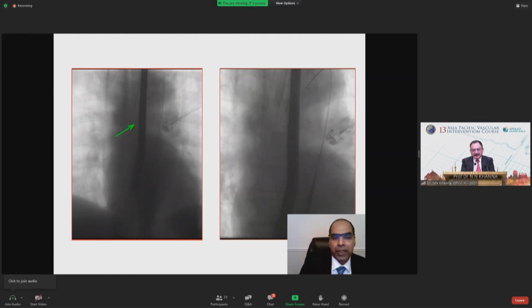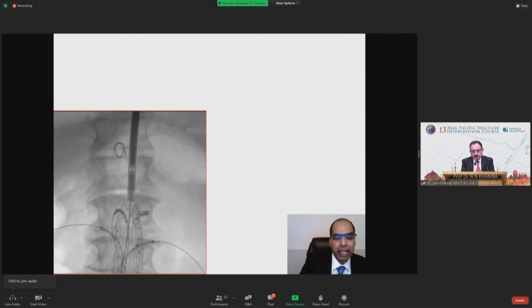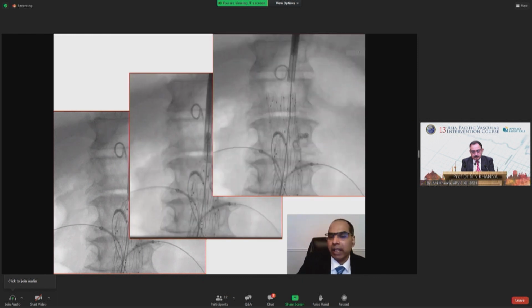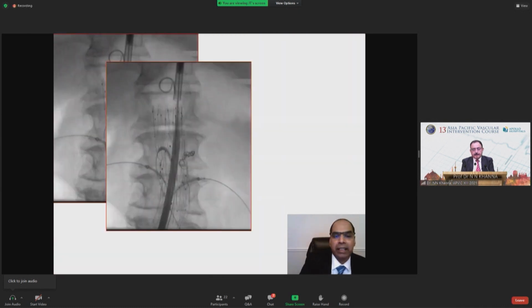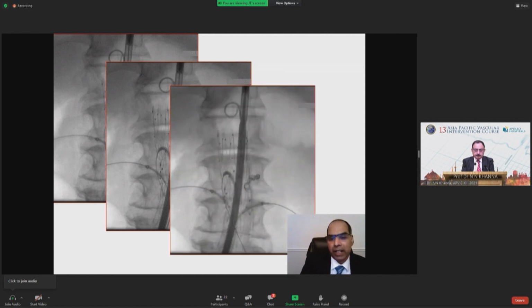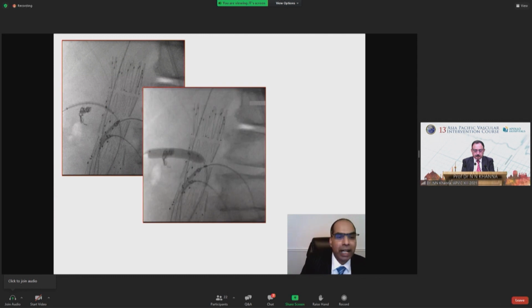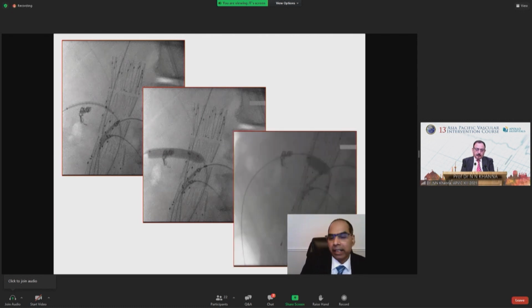And the top position once again is confirmed to make sure there is adequate amount of guide wire, and now the step of firing the top cap of the device, which is just gently pushed away from the fixation stent, and then that is retrieved by advancing the grey pusher central component of the delivery system, and then under vision gradually removed out. And then each of the target vessels or stents are deployed and flared in sequence.